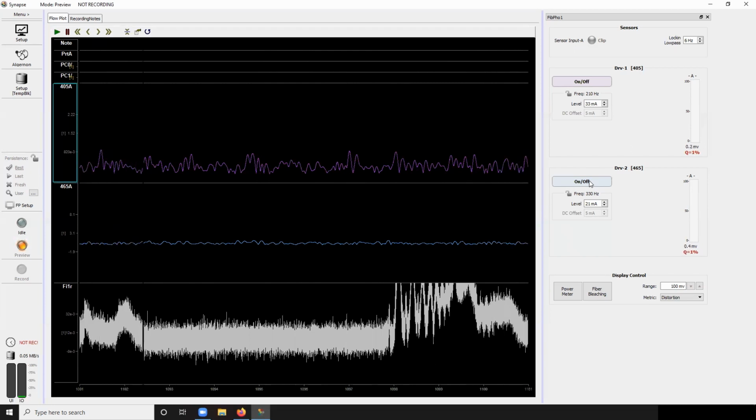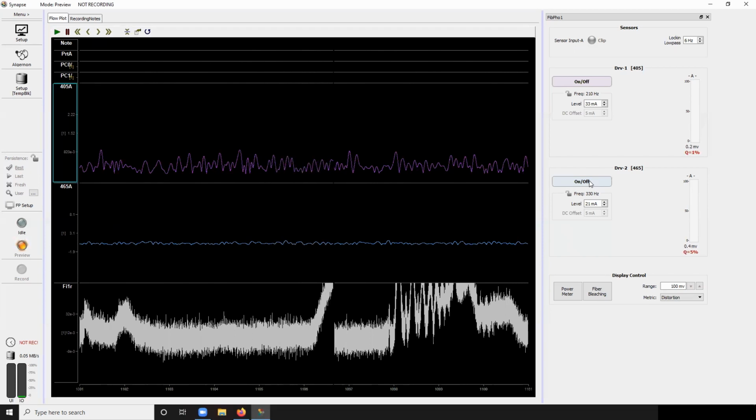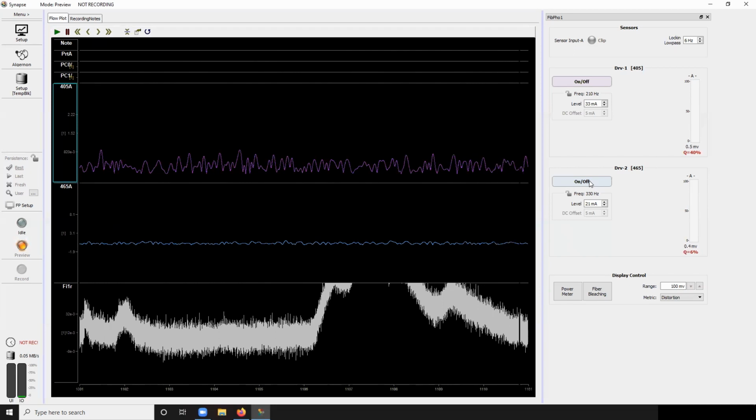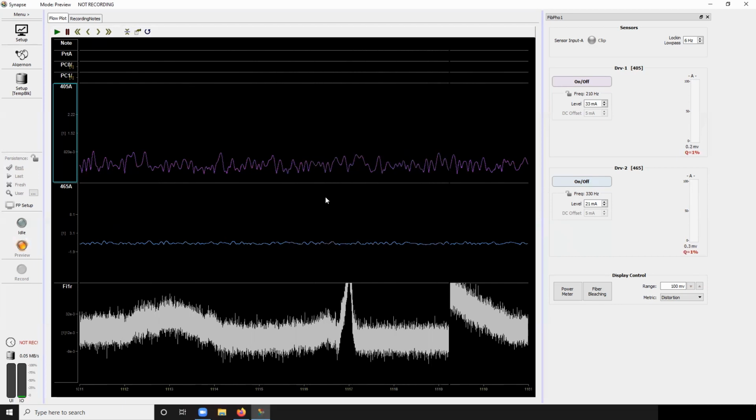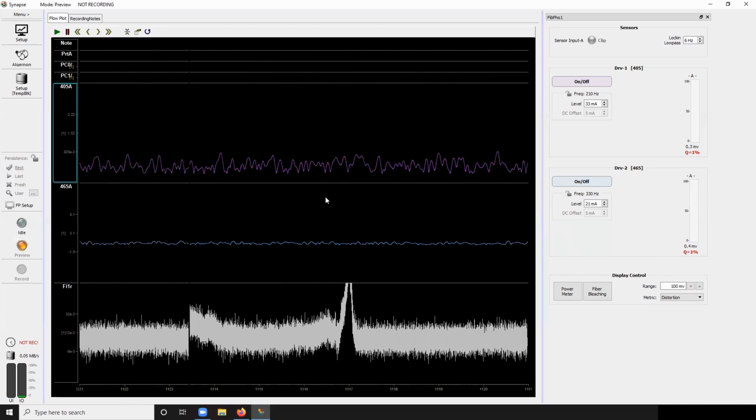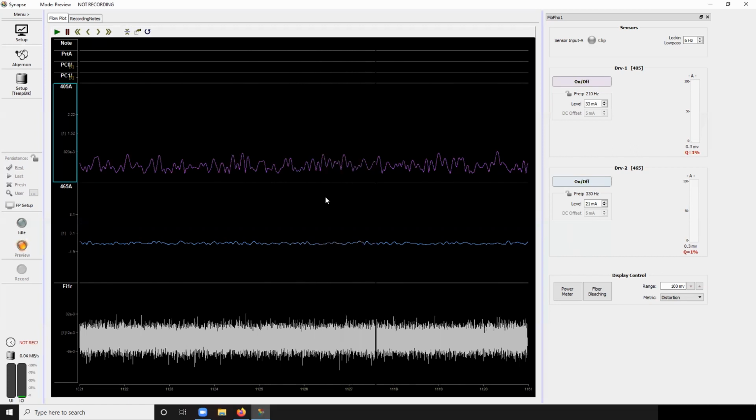And what we're going to do is the black surface is going to be your control, right? Because it's black, it's not going to fluoresce really. There's little to no reflection. So you're going to take the fiber tip and hover maybe 2 or 3 centimeters over the black surface. Okay, you have fluorescent lights too. That's great. But the highlighter test, same deal. So we'll turn these LEDs on.